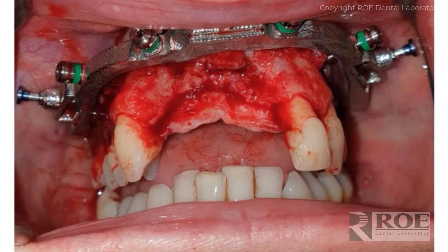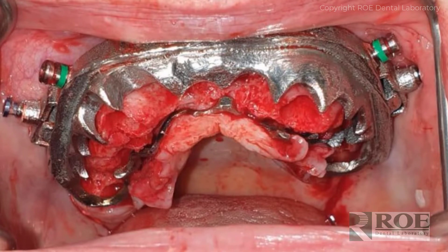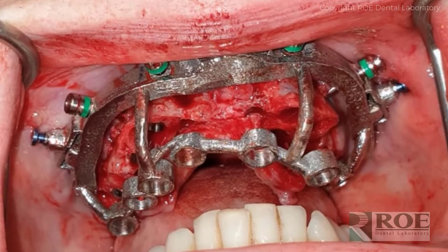There's really nothing else like it on the market, and it is a patent-pending process. Once the fixation base is in, the teeth are extracted, and then the doctor places the scallop guide. The scallop guide helps the doctor determine where to scallop the bone to accept the prosthetic and the implants. Every time there is a gingival zenith area, the burr goes in and preps. We went back to a full wrap design — lingual and labial. This does not go deep into the vestibule like a plastic guide; it's a very shallow metal guide, and because it's metal it doesn't have to go deep.